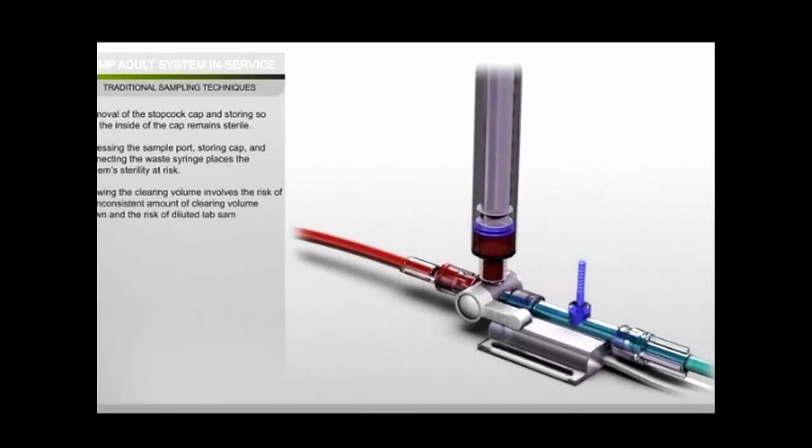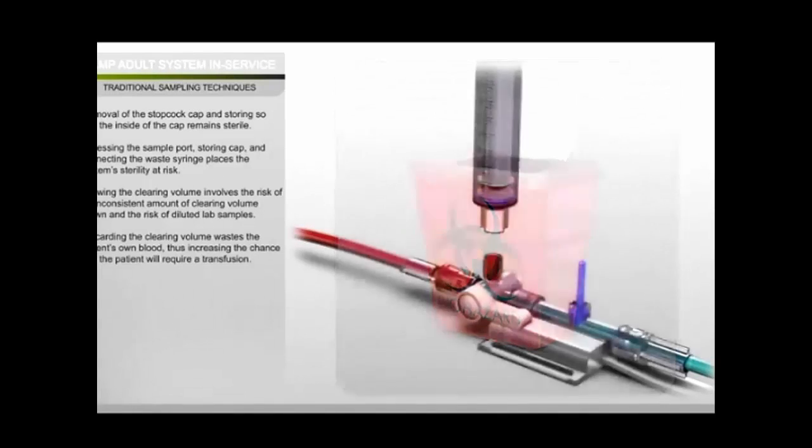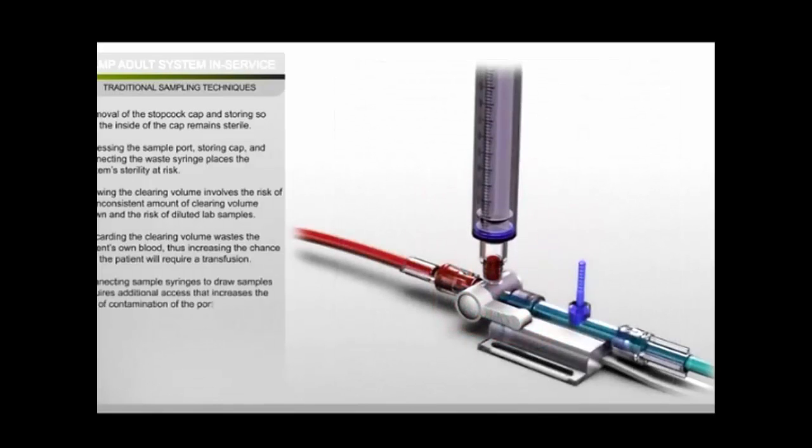Drawing the clearing volume involves the risk of an inconsistent amount of clearing volume drawn and the risk of diluted lab samples. Discarding the clearing volume wastes the patient's own blood, thus increasing the chance that the patient will require a transfusion. Connecting sample syringes to draw samples requires additional access that increases the risk of contamination of the port.